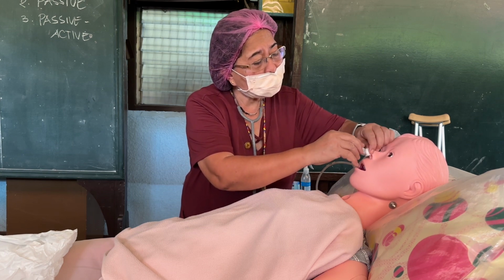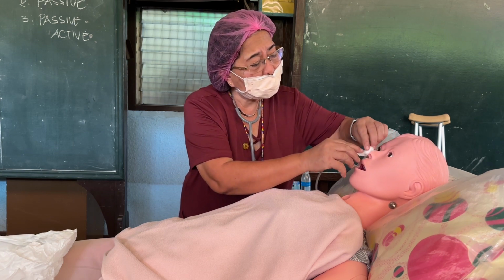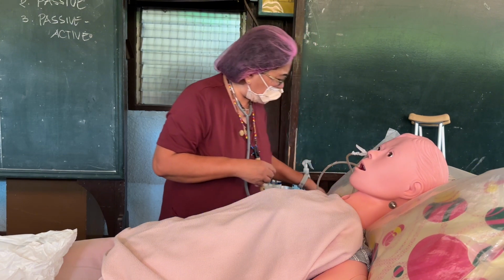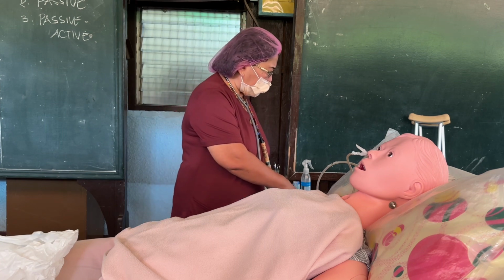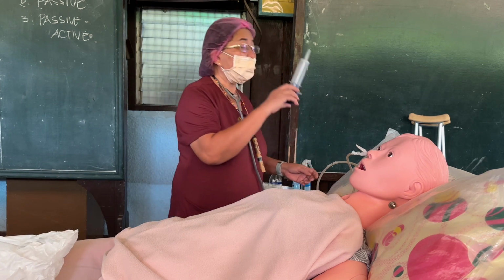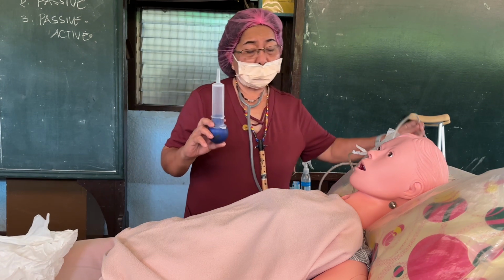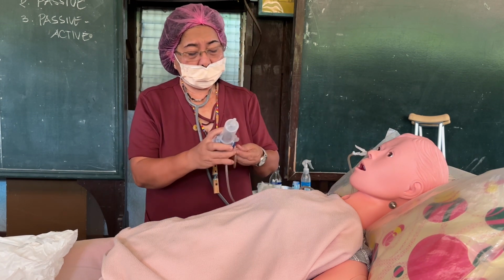You talk also to your patient, class. Your patient is not a robot, right? The patient is a person. Then you aspirate 50 ml of PNSS. I confirm the five ways, and then kink the tube.